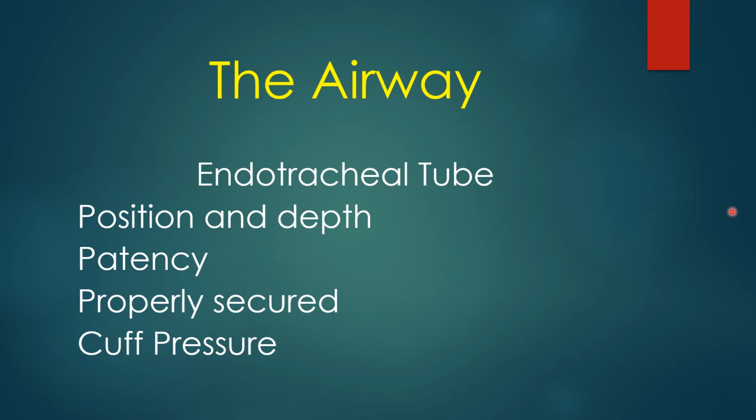You want to check the patency of the ET tube. So you put your suction catheter down, and you should not feel a point where it gets sticky, where it gets harder to pass the catheter through the tube. That catheter should go down easily all the way to the end of the tube. And when you feel a point where you're going down where it gets difficult, that's something happening to the patency of the tube.